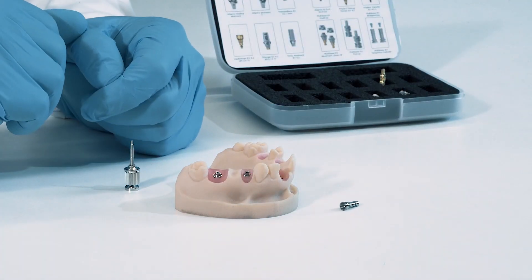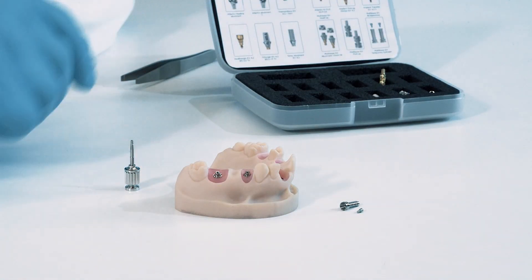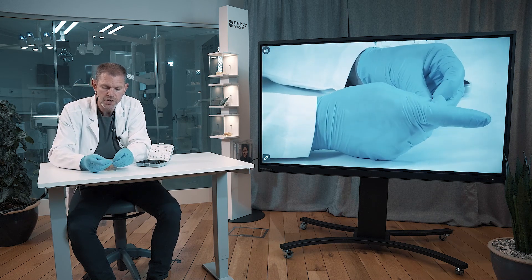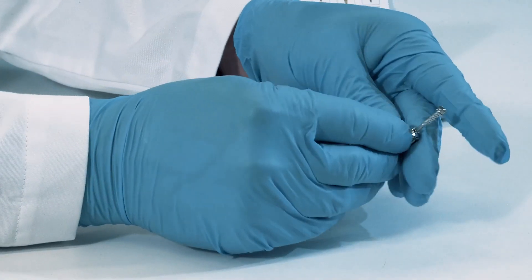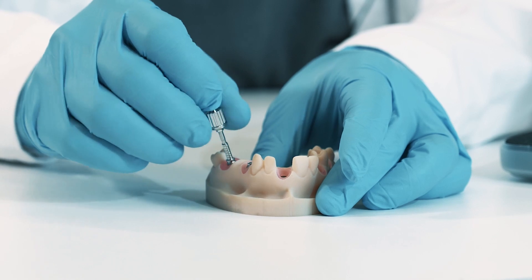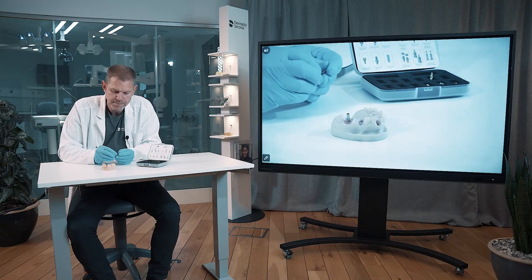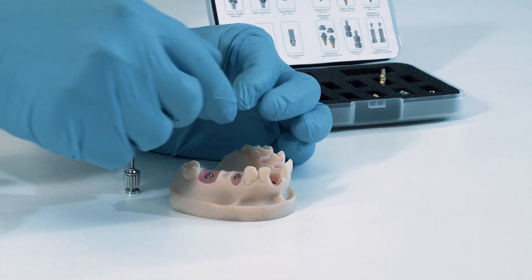There are many ways to temporize and do the final construction on these abutments, but we have chosen to take the temporary cylinder together with the bridge screw, just to show you how easy it is to place one of these cylinders onto the multi-base. I put the screw onto the hex driver, then put that into the temporary cylinder and tighten it down in place. Then you're ready to make a temporary multi-unit restoration.